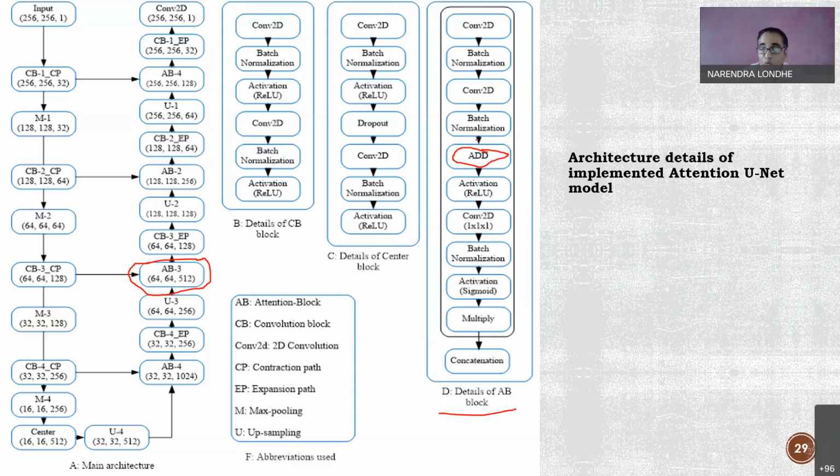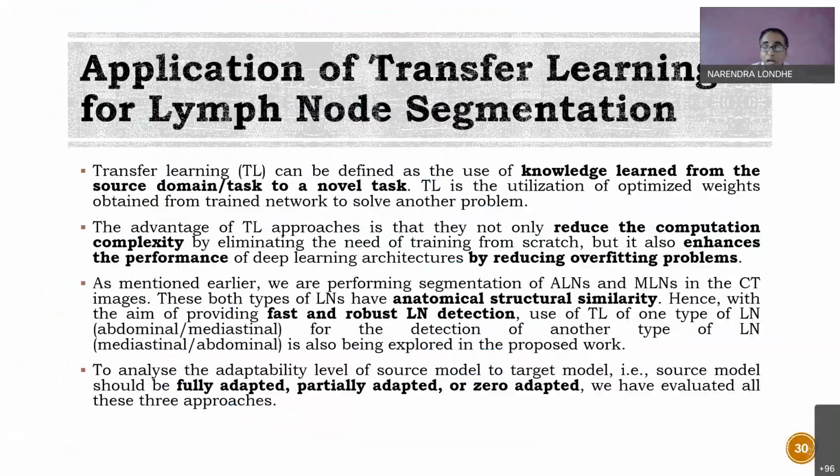So here I'm using the add function, right? Here this is for the linear, and here I'm using a sigmoid as the activation function. This is doing the non-linear transformation. So I'm doing a linear transformation here and a non-linear transformation in the attention block, and that is how I'm making my system focus more on the target. Okay, so that is exactly the idea.